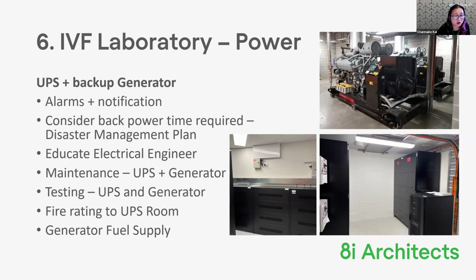A lot of engineers will probably try to talk you into reducing the time of the UPS simply because they'll say that the backup generator will kick in. There've been several cases in Australia where the backup generator, the hospital backup generator connected to the lab, did not work. There were quite significant losses in the IVF lab because the UPS was not designed to cover for what should have been the backup generator kicking in. So the time for the UPS wasn't enough.